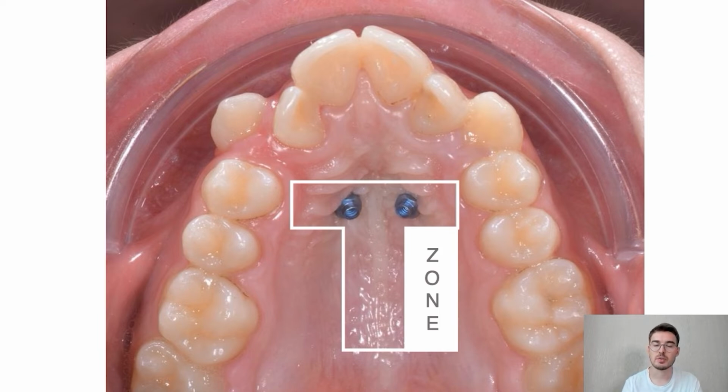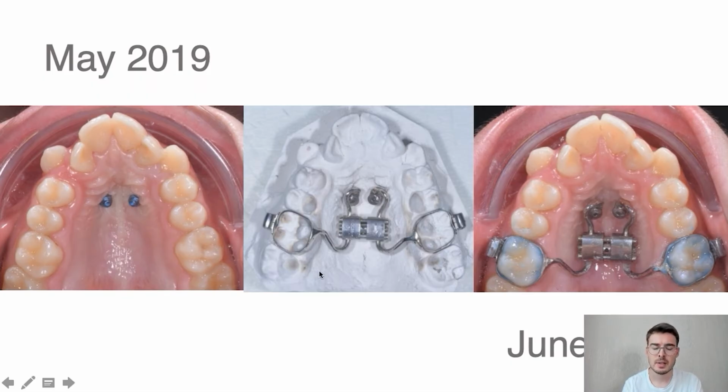In this case, we have installed 2 microimplants in the premolar region. They are actually very easy to install. I rely on the analog method. We sent everything to the lab, and the technician made the simplest device possible, and we transferred it into the oral cavity. In this course, we will look into mistakes every doctor makes, especially those who analyze their medical cases.